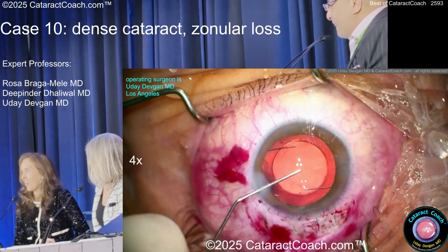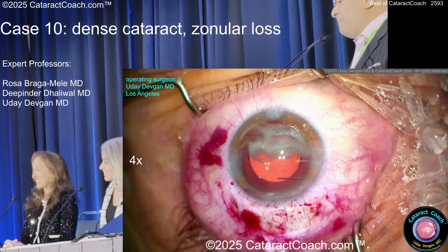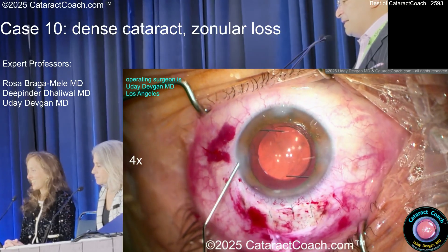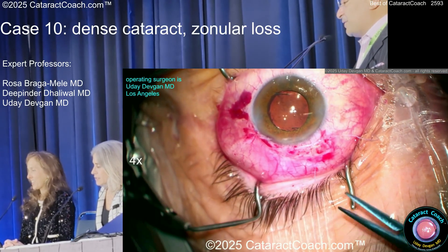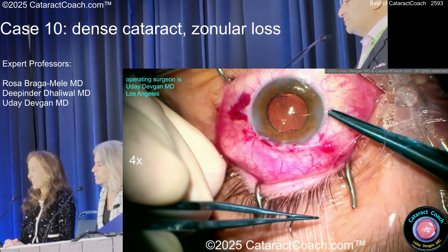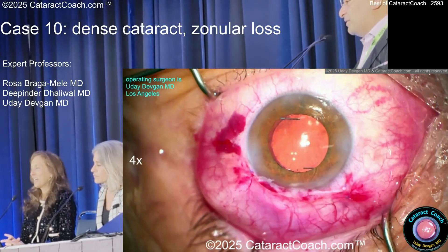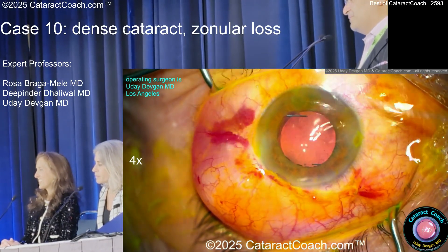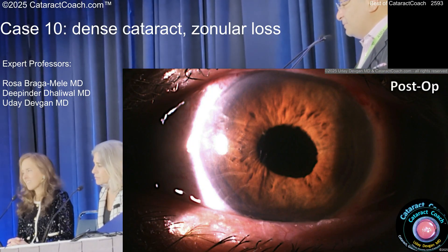A little more trypan just to be sure. I put some preservative-free moxifloxacin in the eye. Now closing — conjunctiva with Vicryl, although you can also close conjunctiva with cautery. I use Vicryl. Make sure everything is right — I don't need any reflector. Beautiful post-op day one: cornea looks pretty reasonable, a little Descemet's fold.